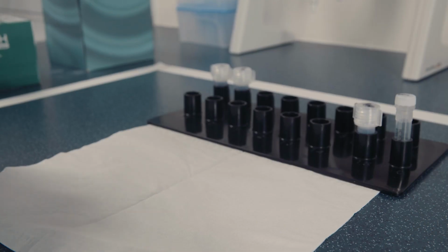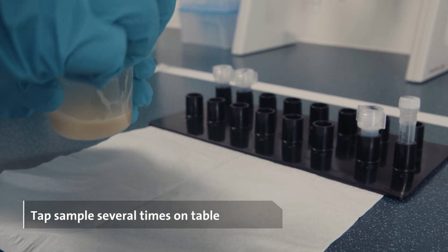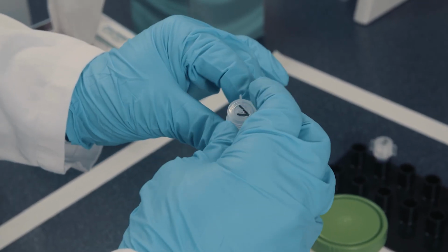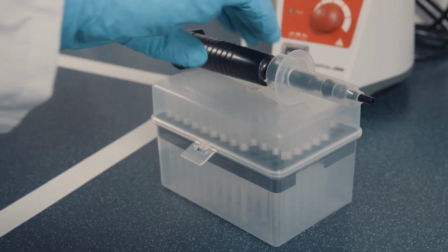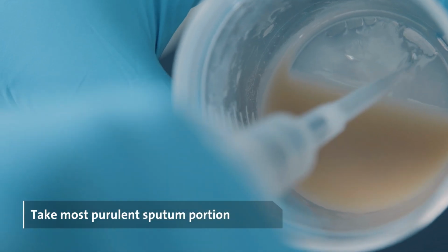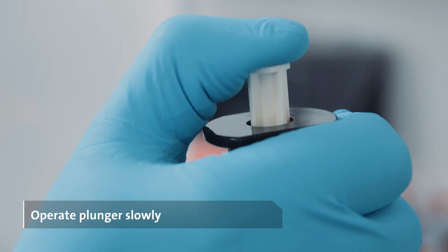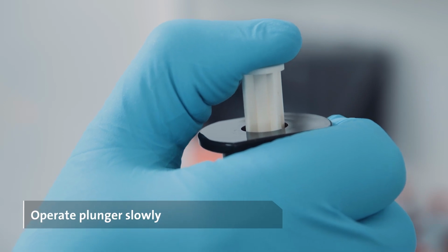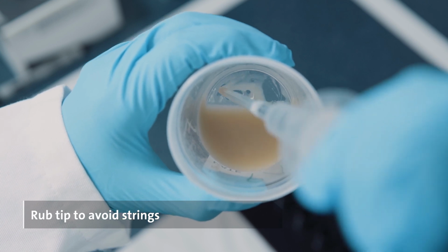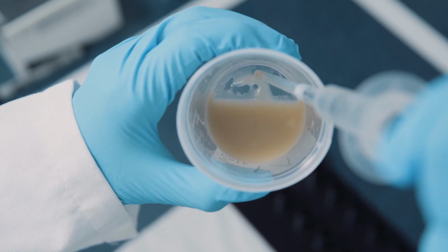Take the first sputum sample and tap it several times with the edge on the table. Open the container and the heating tube. Take the Pipette 60 and take the most purulent sputum portion of each sample. Make sure to operate the plunger of the pipette slowly. Rub the end of the tip on the bottom of the cup to avoid strings. Repeat the procedure until there are no more strings.